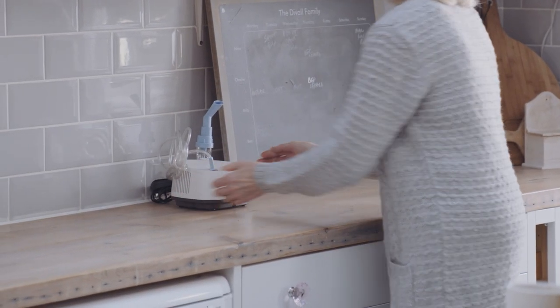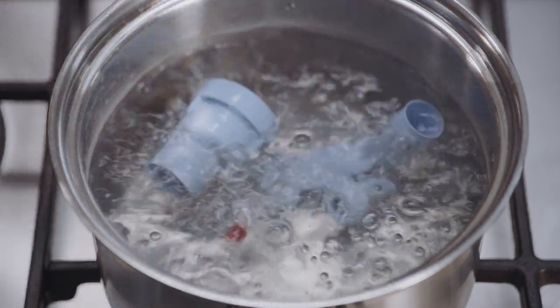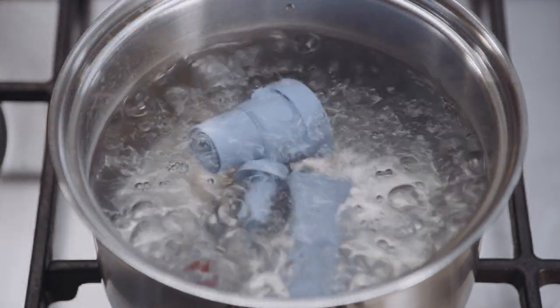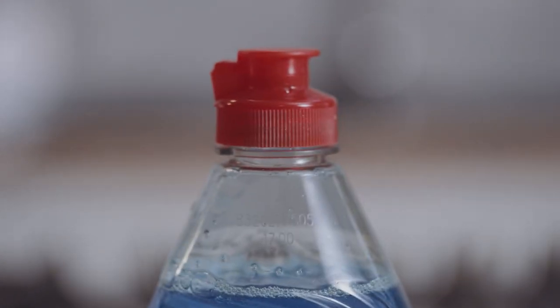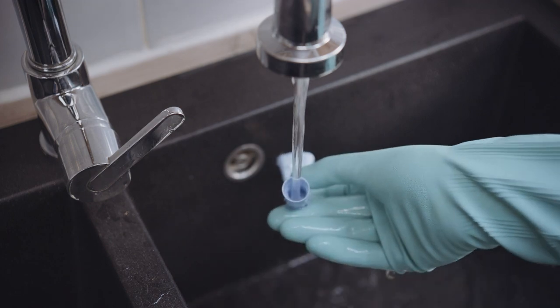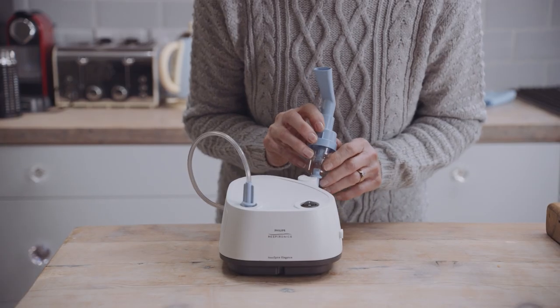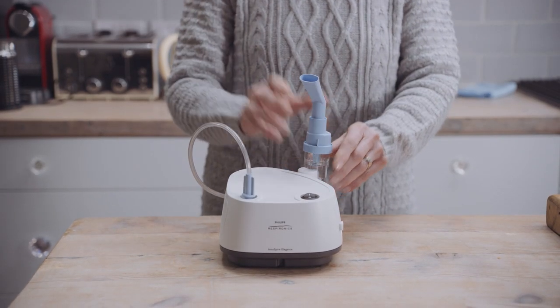Reassemble and store the Sidestream in a clean place when not in use. Once a week, boil the Sidestream — but not the face mask and tubing — in water with two to three drops of dishwashing liquid for ten minutes. Rinse all parts of the Sidestream nebuliser cup in clean water for two minutes. Shake off excess water and leave to air dry. Do not towel dry. Once dry, reassemble the Sidestream for storage.